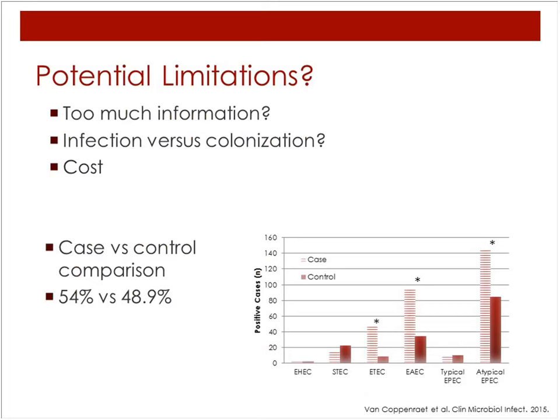There are, of course, limitations to the GI panel, including the fact that maybe there's just too much information. And because of that, and the fact that it is also very sensitive, you may be picking up colonization versus actual infection. And lastly, the cost of the test itself may be of concern, particularly the cost to the patient themselves and reimbursements from insurance.